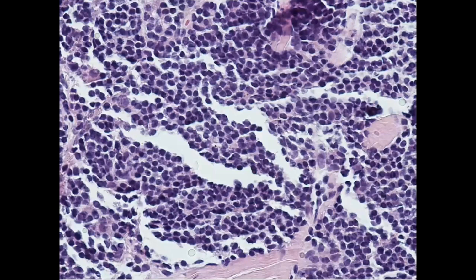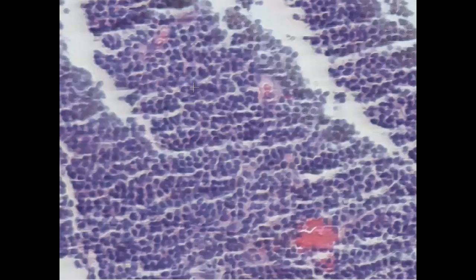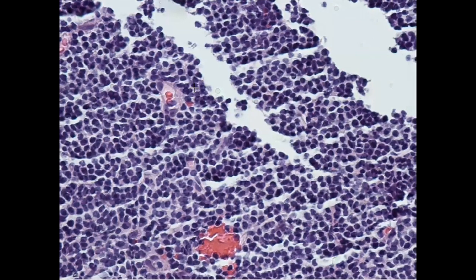But let's agree on one thing, that we have small to medium size cells, and they have this plasma cell differentiation. I will go around, maybe we will find any different findings. These are just blood vessels.